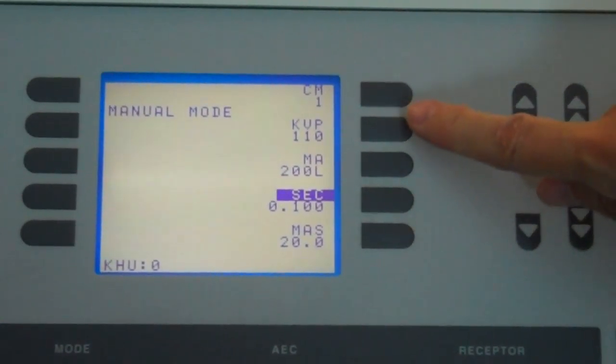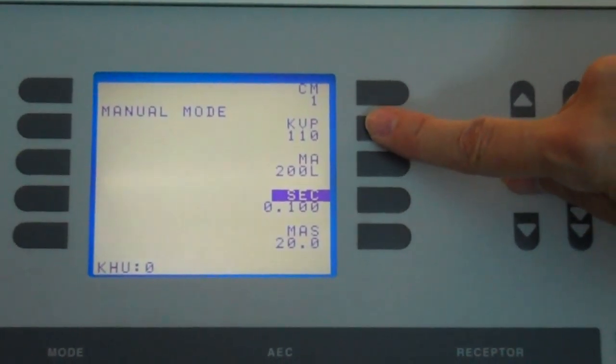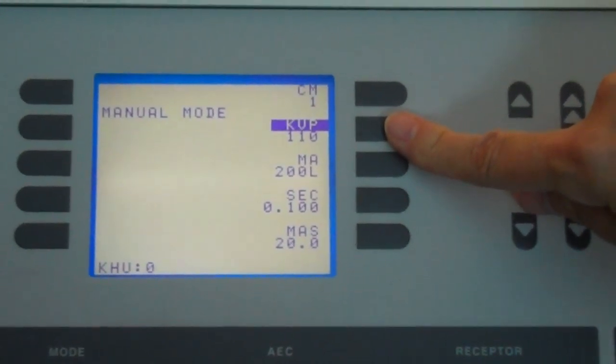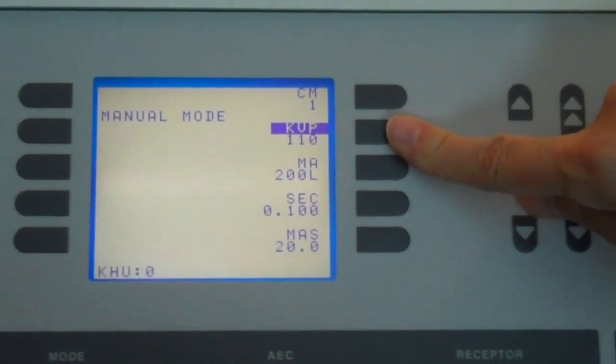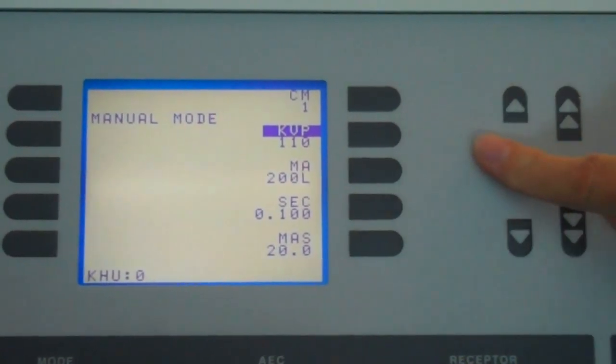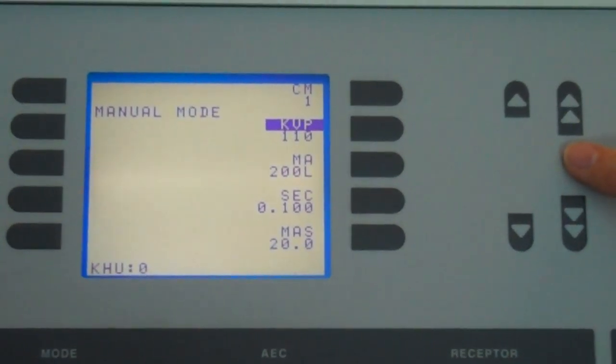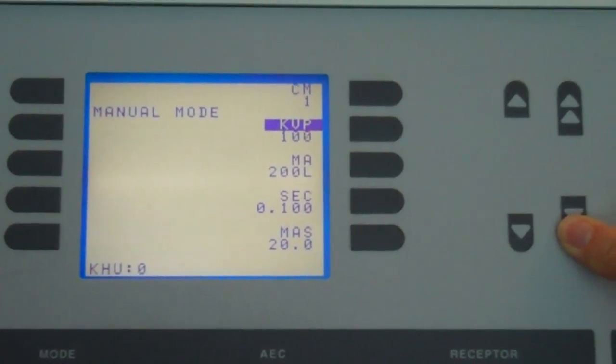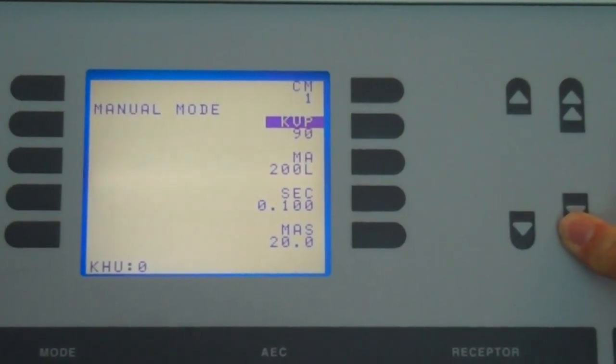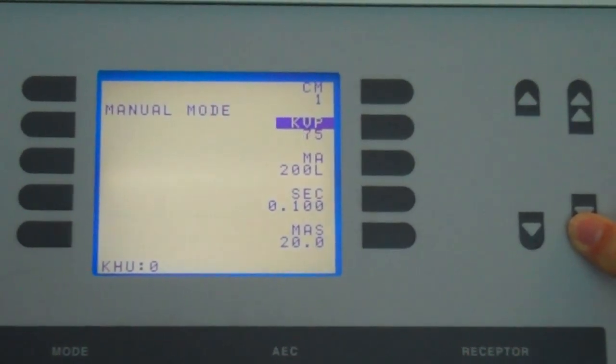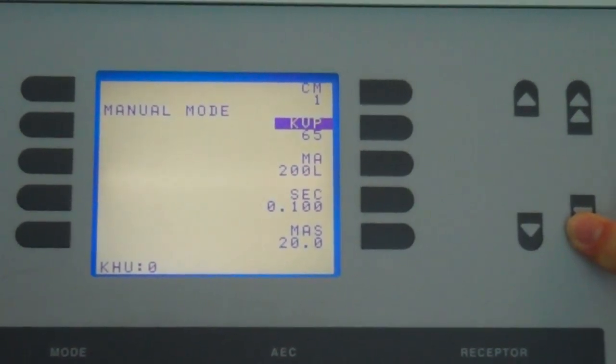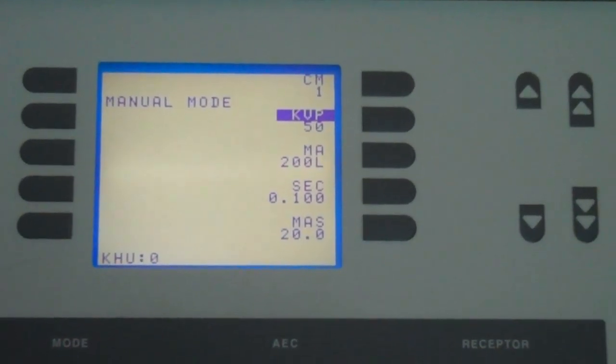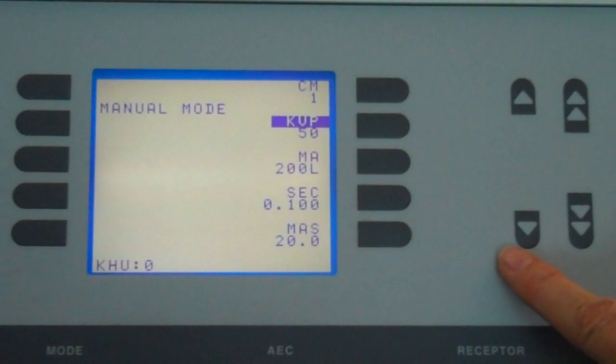KVP is your last selection. And for KVP selection, we want to start at 50 KV. We will go to our arrows and we will arrow down until we reach 50.